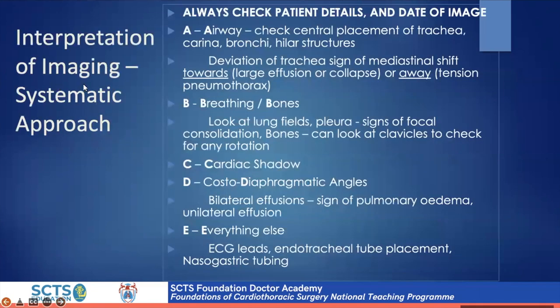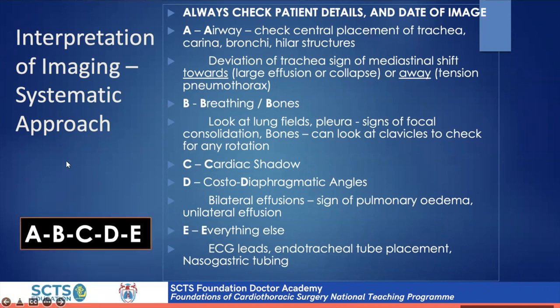Okay, so interpreting an image and being systematic with this using the A to E approach. As I've mentioned, the most important thing is to make sure we don't have the wrong patient and we're not looking at an image from a year ago or a week ago, and that we're looking at the correct image that we want to look at.